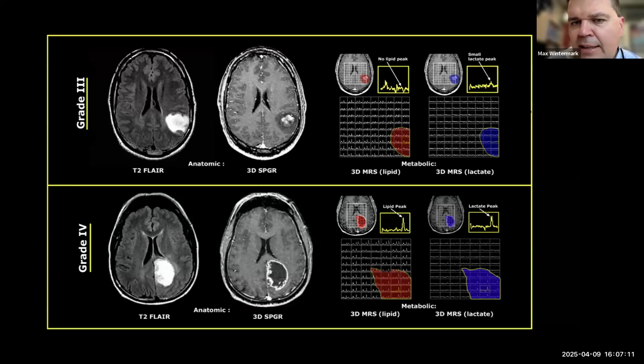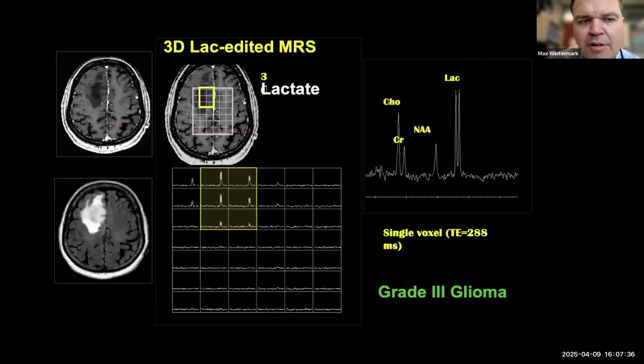And so that's why typically, as I told you, we get the spectroscopy as part of our advanced brain tumor imaging protocol. But again, we look at those patients first, because if we see that the lesion is too superficial, or if the lesion contains too many blood products, we're not going to expose the patient to 10 more minutes in the scanner when we know that we're not going to get any meaningful results.